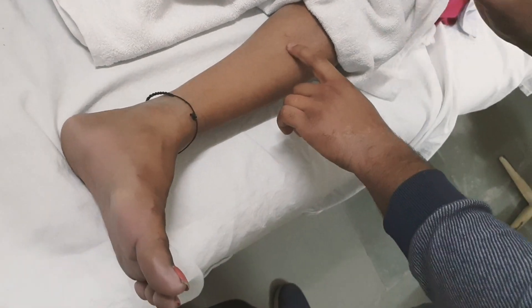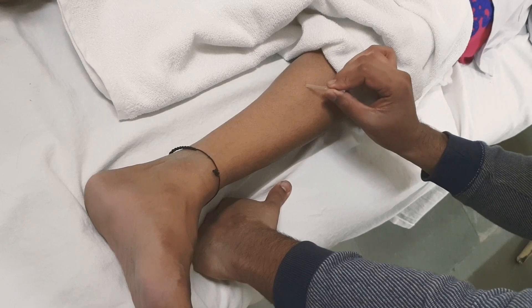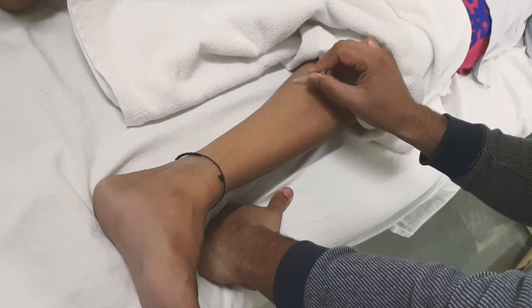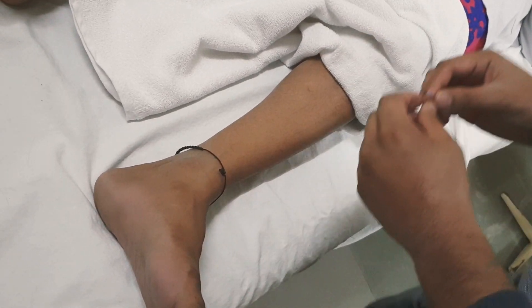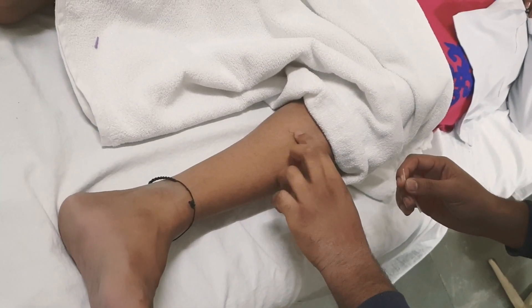The needling direction will be anterior to posterior and medial to lateral, but not piercing into the calf — along the shin of the tibia.